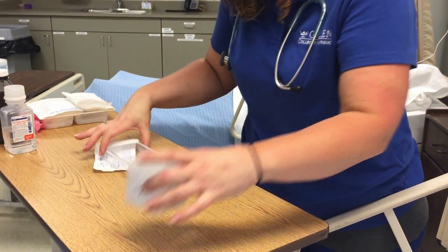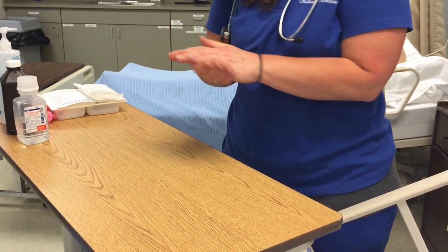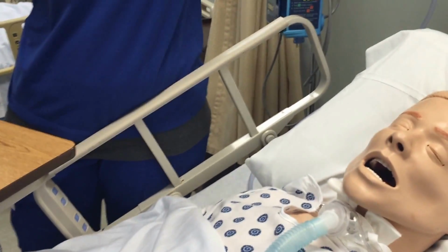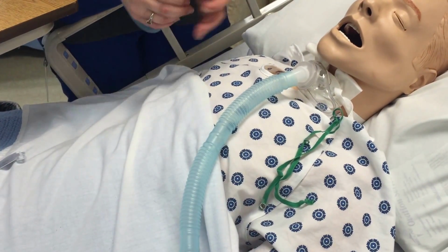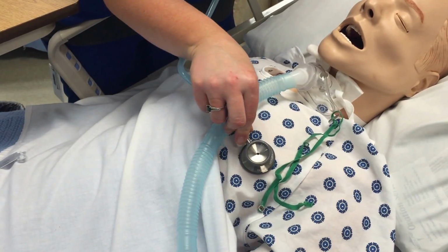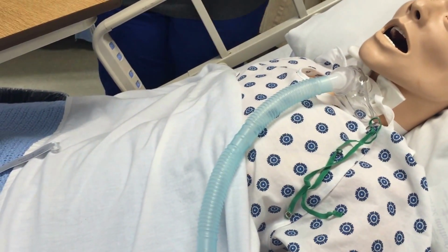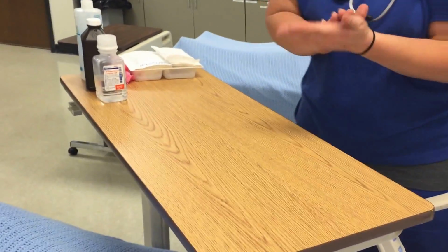Okay, Miss Dan, I'm gonna put my stuff here to the side. I'll clean that up in just a second, okay? And we're gonna go ahead and do your trach care. You doing okay? Did you tolerate that all right? I'll just take one more listen to you and do another set of vital signs, see if your respiration's got any better. You were a little tachypneic there for a second. Oh, lots better. Much more clear. You don't sound so gurgly now. Not hearing as much rhonchi. All right. Okay.